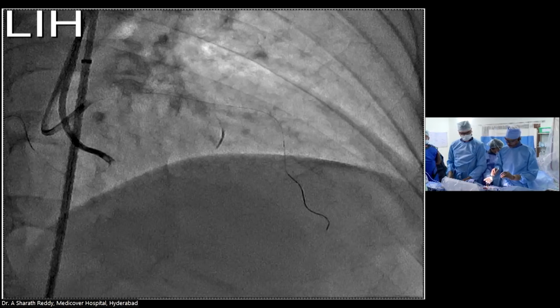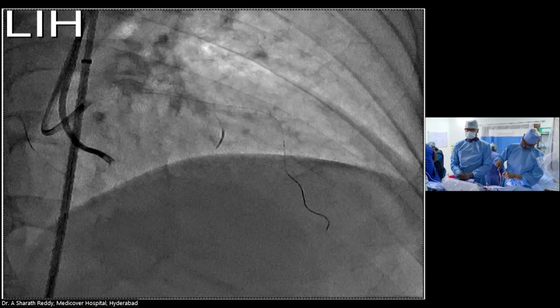I think the first point that I would like to make is the very positive use of the CT angiogram to delineate the anatomy, identify the proximal cap, and identify a proper view for attempting the proximal cap antegradely. That was a great demonstration. The CT, IVUS was not. Antegrade first.